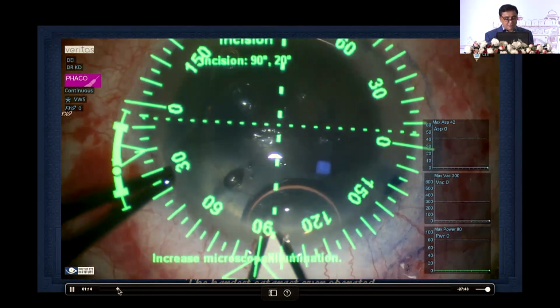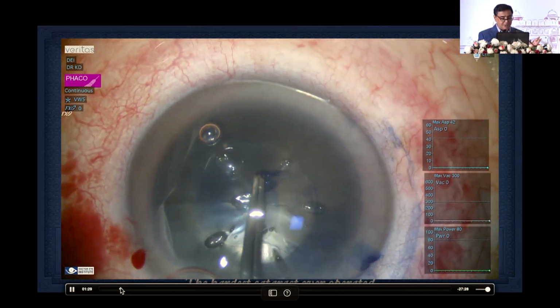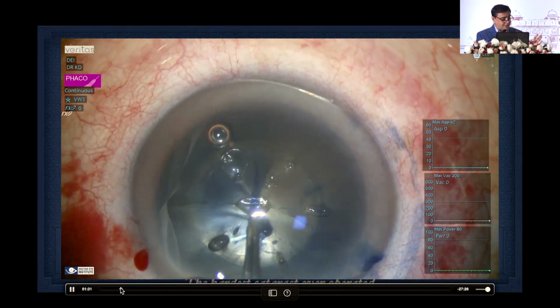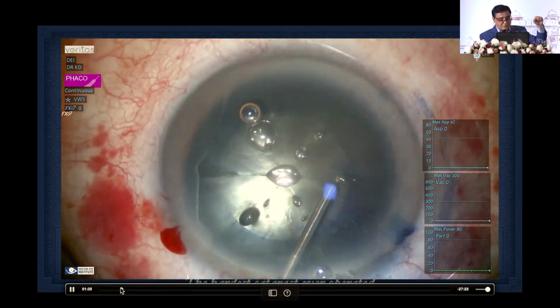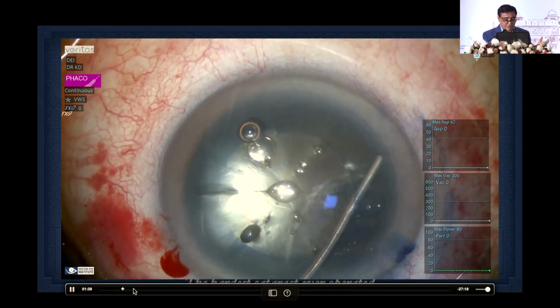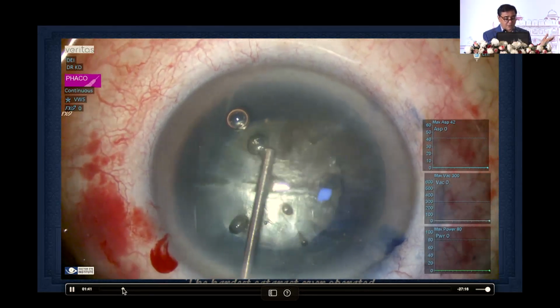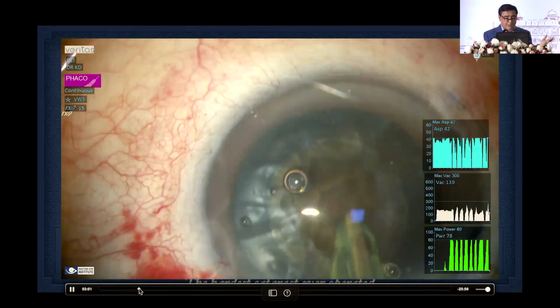Make your incision, go ahead and do that. And then gently make sure that your CCC is complete. So I'm gently lifting the CCC and removing it with the help of a forceps. It's like you pinch a handkerchief off from there. And hydrodissection, of course, has to be very, very gentle. Obviously, there is no space, as you saw in the clinical picture, that it's a very, very hard cataract. Now I'm going ahead and seeing what I can do next.